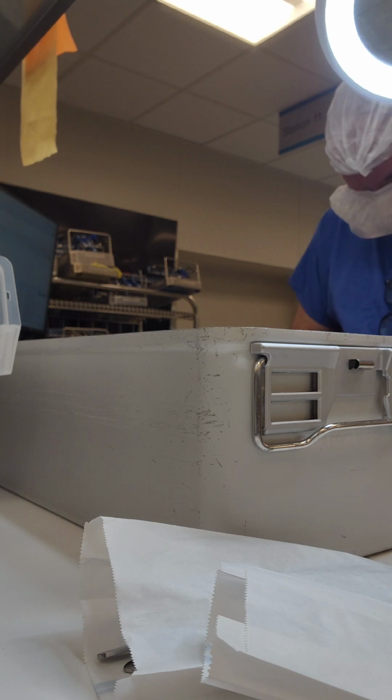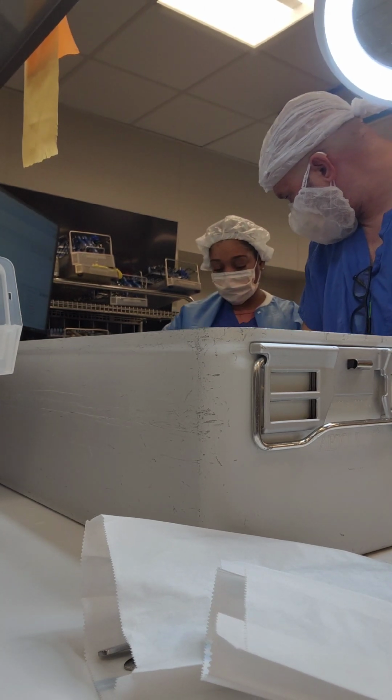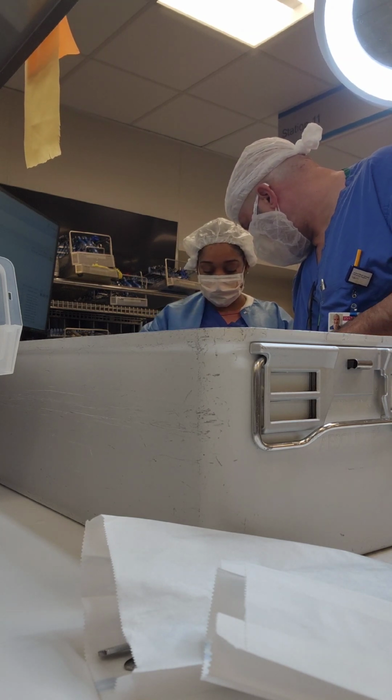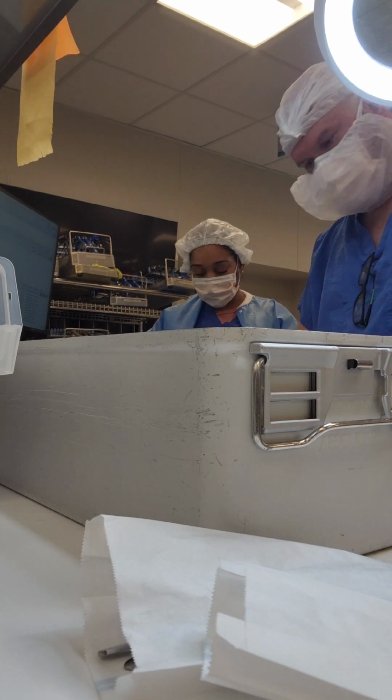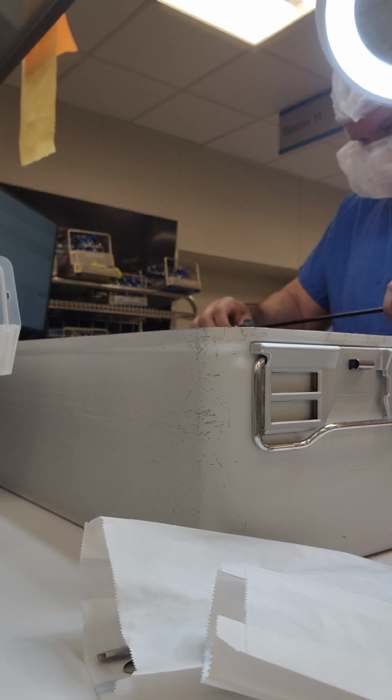The forceps that I had laying on the top, I wind up putting them in the bottom basket, standing up. Again, another question that was being asked. So help that out real quick.